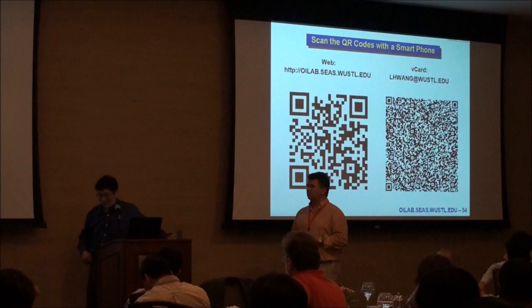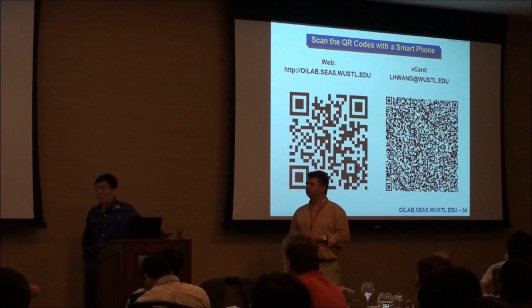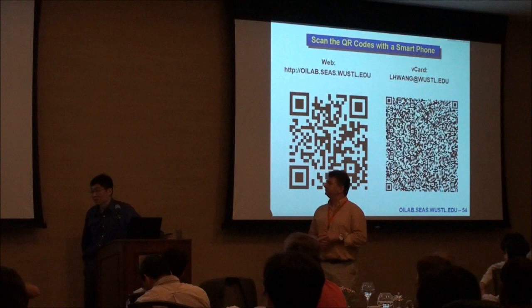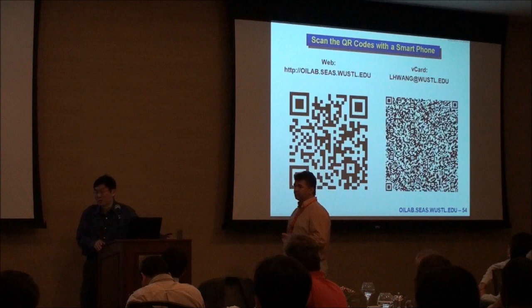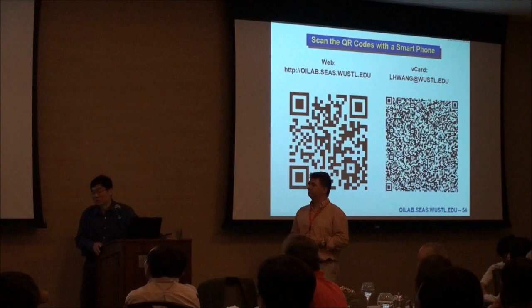One of my former students is now looking at the retinal images, so you can see the retina as well. That's actually a very exciting direction. One of the key applications is to quantify the oxygen saturation in the retina and see if there's hypoxia, for example. It's pretty hard to do using other modalities. OCT is so fantastic in the eye, but it's not sensitive to absorption. Oxygen saturation depends on the optical absorption, so you have to measure optical absorption to do it. So there may be some potential applications for photoacoustics.